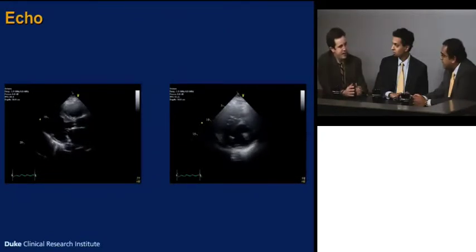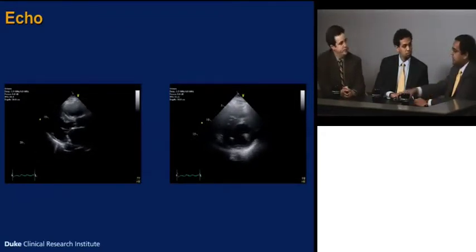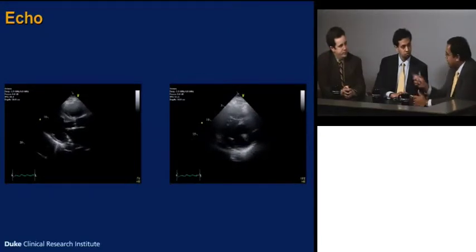So I think that's the challenge here, and you can't just rely on one single test to evaluate the etiology. Yeah, I'll say in our MRI lab, we did a cohort study that I think some of our fellows have shown, and it doesn't quite hold, like you said. It's about 70% sensitive and specific for both ventricles or wall motion abnormalities. One of the biggest drivers is if they had a left bundle branch block, which seems to really affect wall motion.